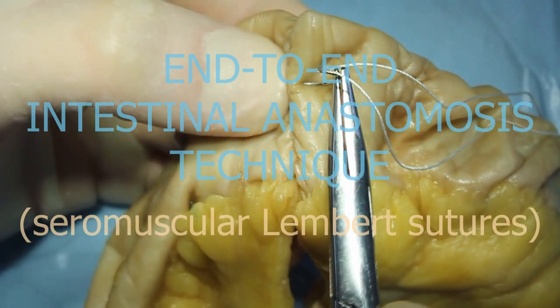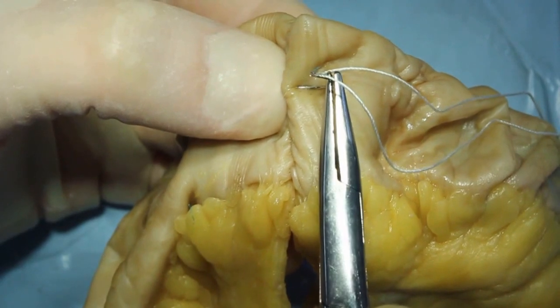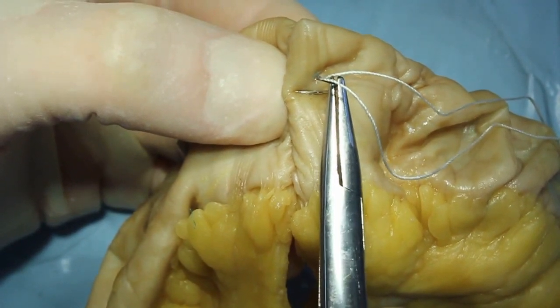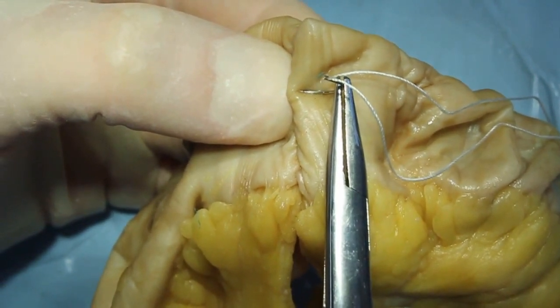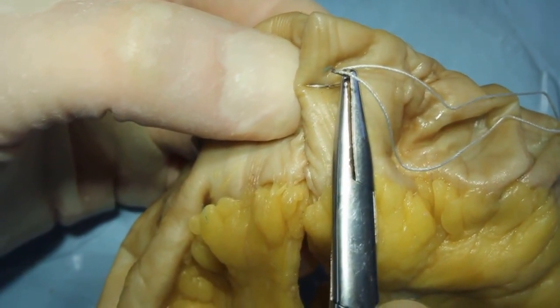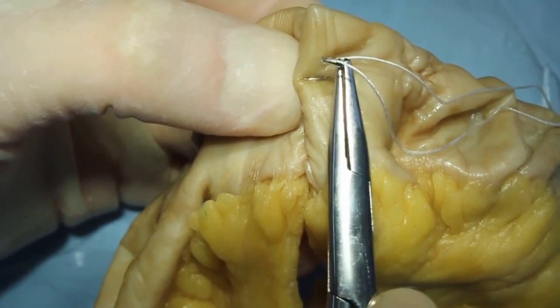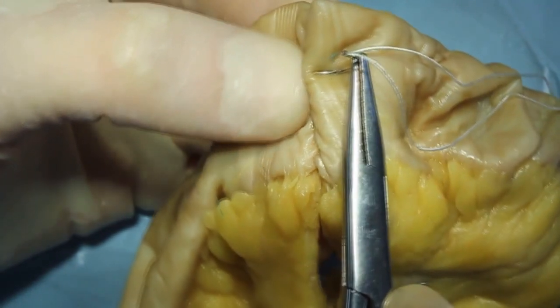After the posterior and anterior lips of anastomosis have been connected by dirty sutures, a continuous blanket suture and Schmieden suture, clean interrupted seromuscular Lembert sutures are put. They are done without application of anatomical pincers.